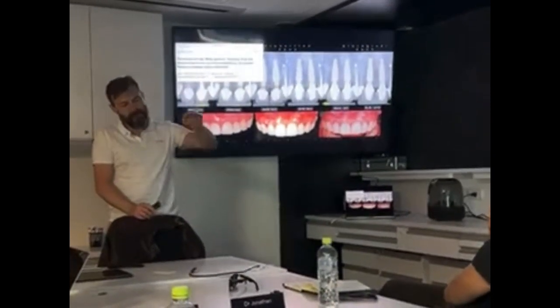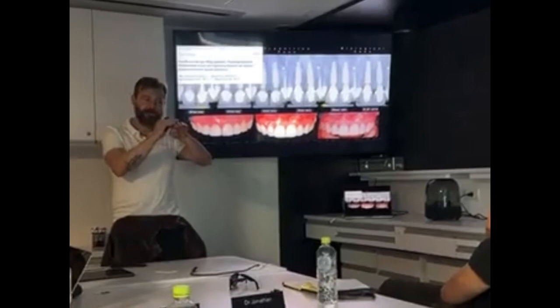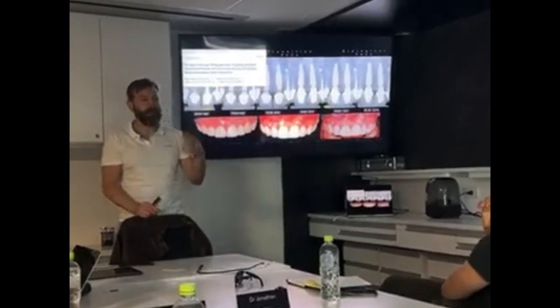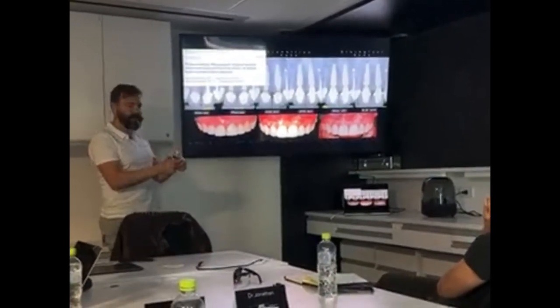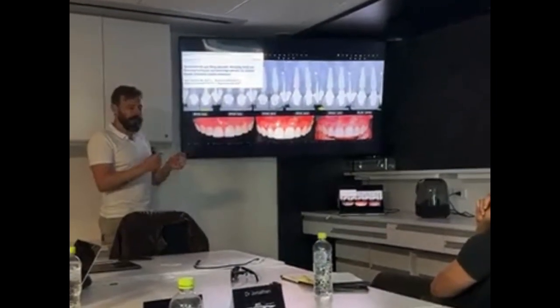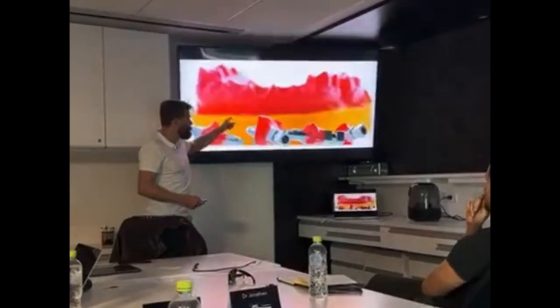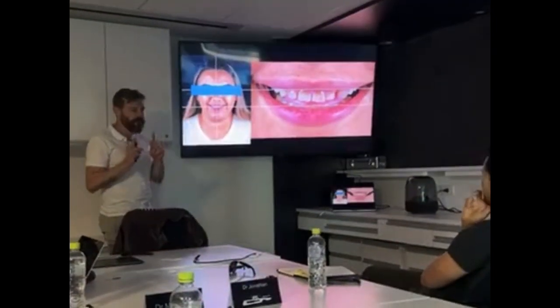When you bring the biomaterial a little bit higher in the socket, you're going to see that there is no space between the provisional and the biomaterial. When you take the provisional, some particles of the biomaterial are going to be exposed, that you can easily remove with a small curette. You can use sometimes a small collagen sponge or PRF interposed between them, but in the practical sense, there is not really much difference in the outcome later, and it's easier for you just to use the nice provisional on that.